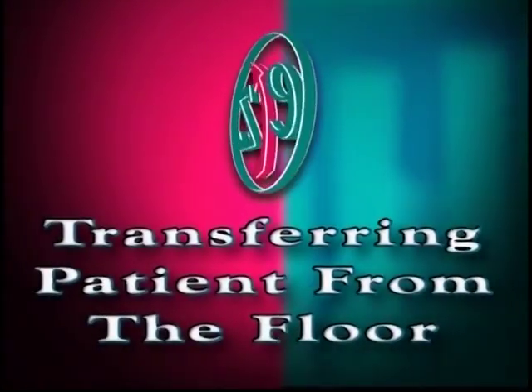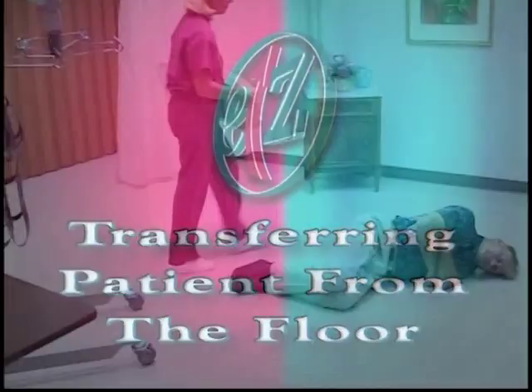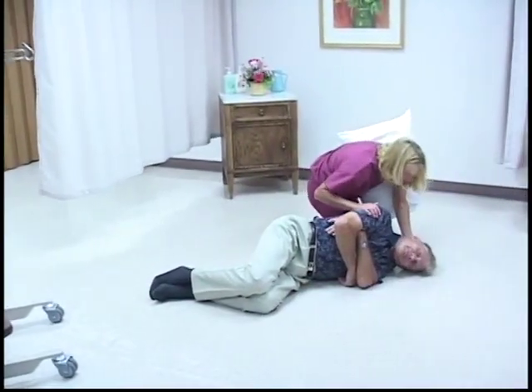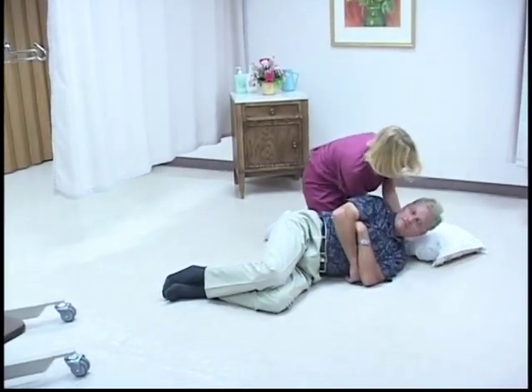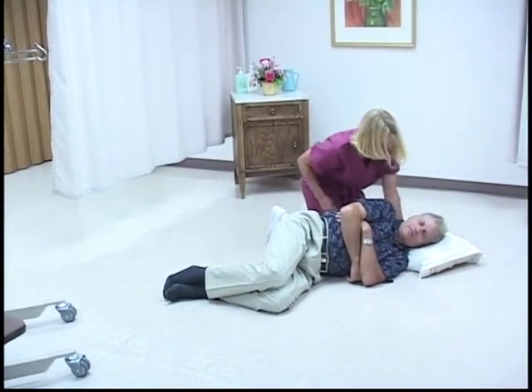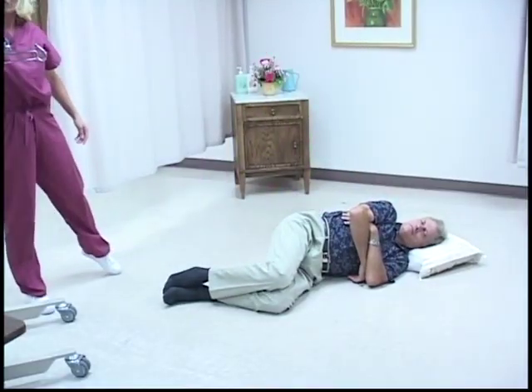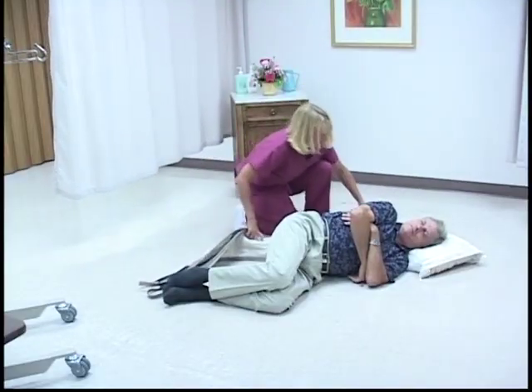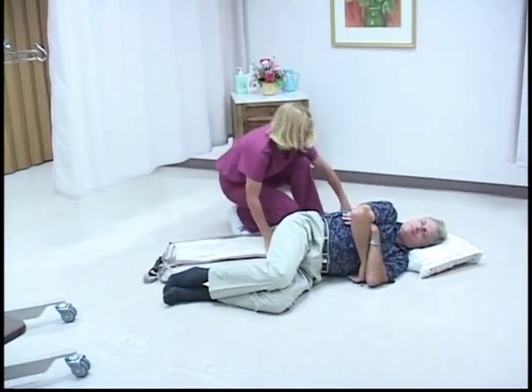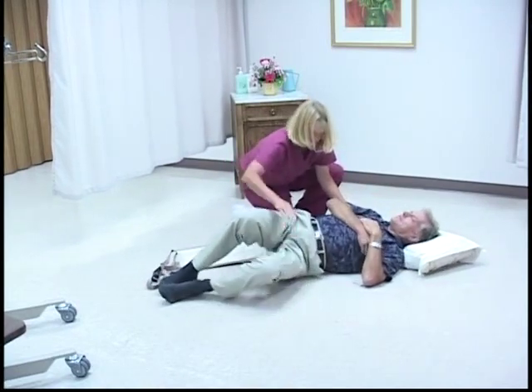Now demonstrate how to lift a patient from the floor. One person can lift a patient from the floor, but it's easier when there are two people. Place a pillow under the patient's head. Position the sling using the same procedure used when transferring the patient from a bed to a chair. Log roll the patient to position the sling underneath so the handles are facing the floor.